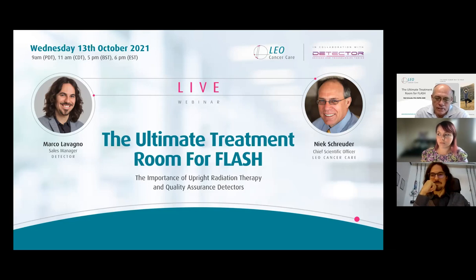I still believe we should be fine, because I don't think we'll ever treat that many patients per hour, because flash will be highly precise treatments, an SRS highly precise setup. So we're still doing that work. The initial indications are that we should be fine, because the CT scanner is in a retracted position way up in the air, about 1.5 meters away from the beamline, and there's really nothing in the patient position that could be sensitive to failure. If we need to go to radiation-hard specific components, we can go in that direction. But for the moment, we believe we're perfectly fine.